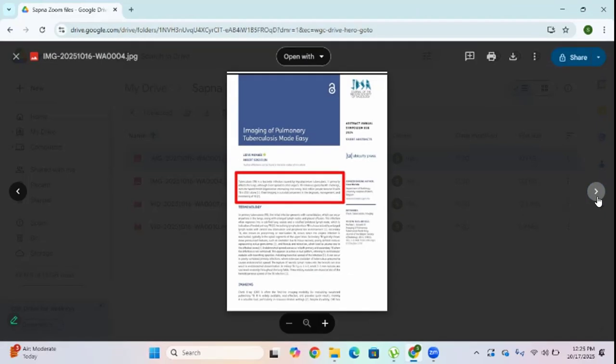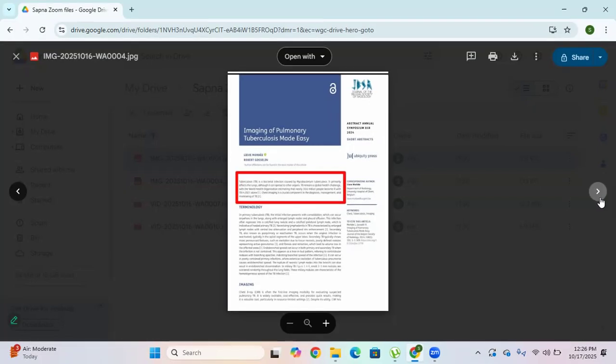So, the importance of radiology is that imaging helps differentiate TB from other lung diseases such as pneumonia or lung cancer, and the various X-rays are essential for diagnosis, while these scans provide detailed evaluation of disease extent and treatment progress. So the textbook here emphasizes that accurate patient positioning, exposure, and interpretation play a vital role in radiography for diagnosing pulmonary tuberculosis.